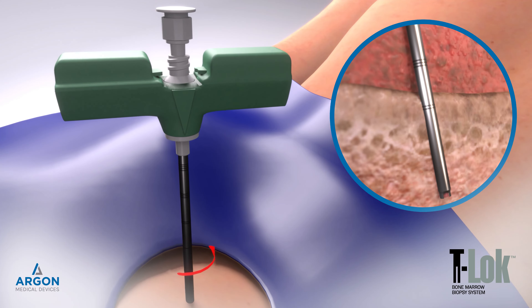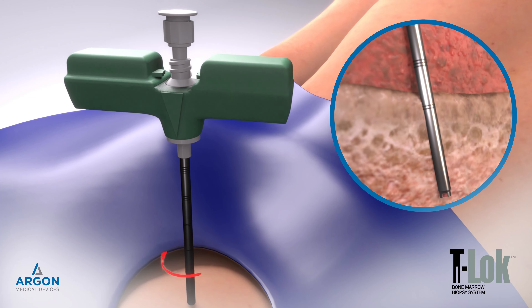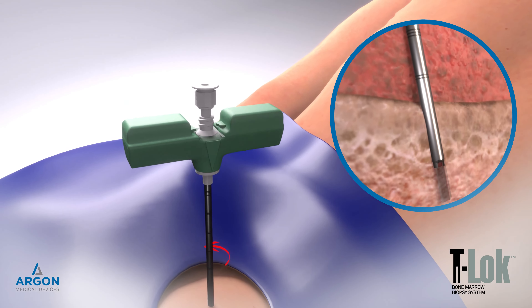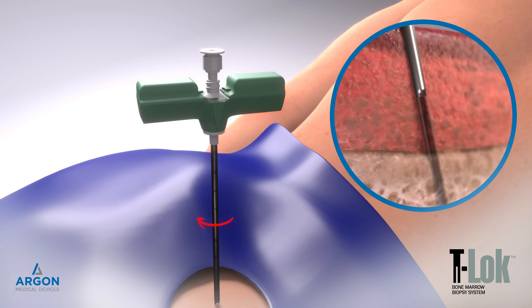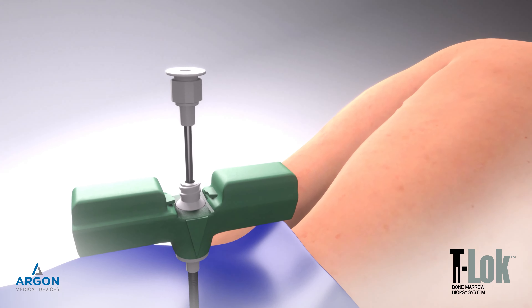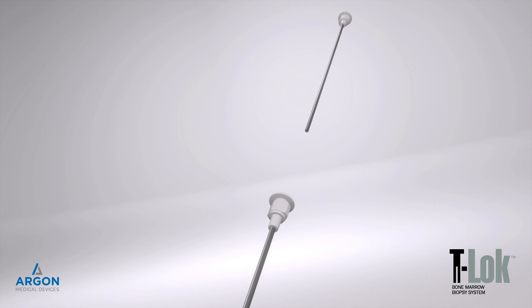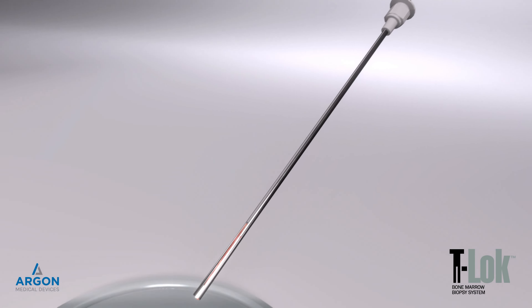Remove the bone marrow biopsy needle and T-Lock extraction cannula together, slowly rotating in an alternating clockwise-counterclockwise motion. Remove the T-Lock extraction cannula from the bone marrow biopsy needle and expel the bone marrow specimen utilizing the marked probe.